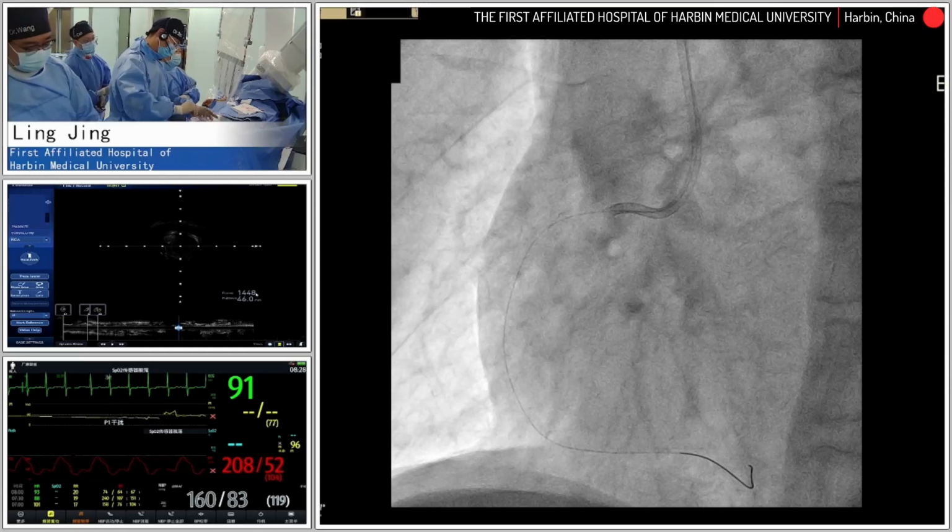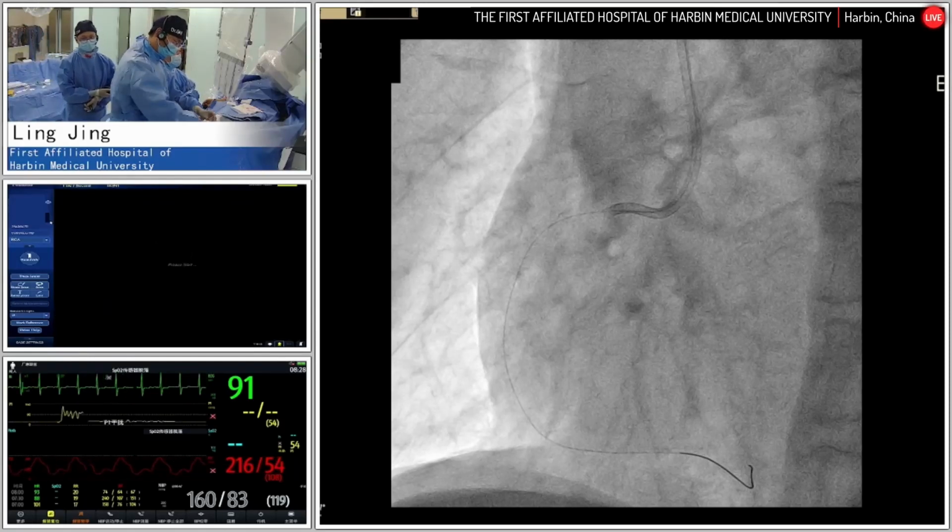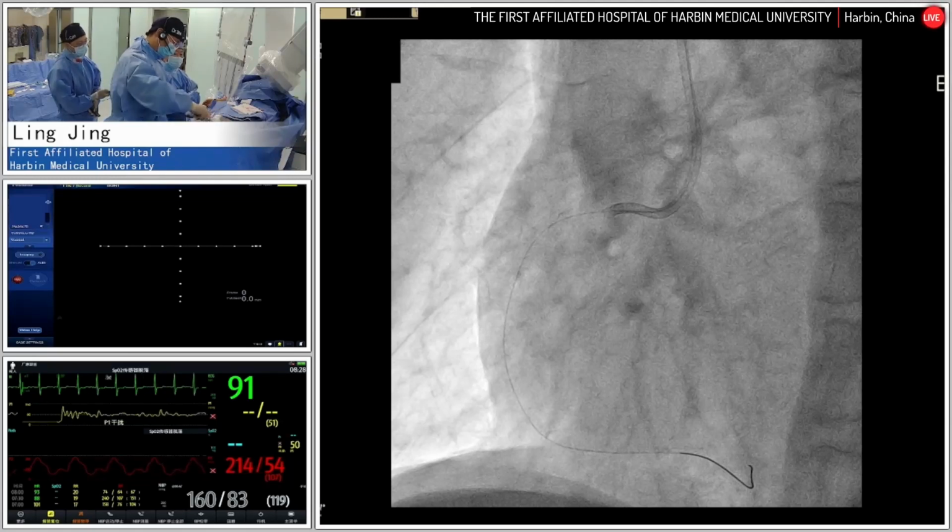It's not like the design of the combined 8+2 wires for the Corsair microcatheter, which you can rotate clockwise and anti-clockwise within 10 rounds to help deliver this microcatheter.